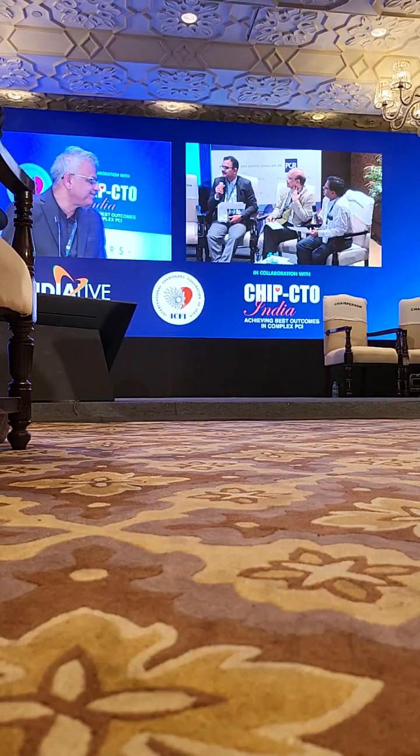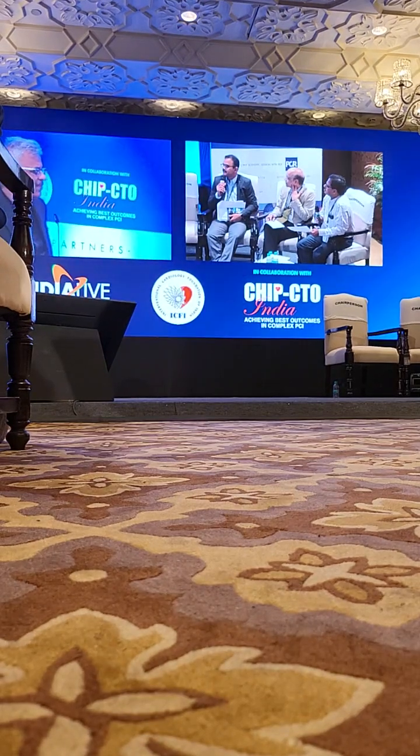Yeah. Thank you. Sometimes the wire gets broken partially and the wire unravels the coil. So sometimes it is very tricky to pull it out. You can neither push anything in nor pull it out. Sometimes it can create... So a parallel wire with a loop and taking it out like a broken wire. It unravels, but not completely. Even then, the unraveled part can... Agreed. Totally agreed. So you just ignore the unraveled segment, go distally beyond into the tip of the segment which is not unraveled, catch it there and pull it. Even then, when you pull it out, the unraveled part can dissect the proximal part. So there are some recommendations that a surgery may be better there.